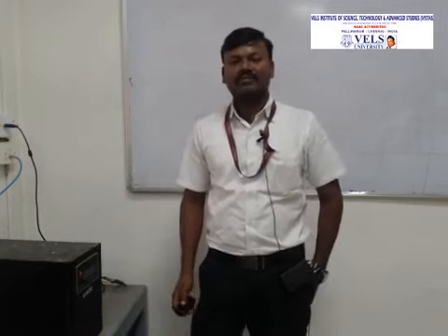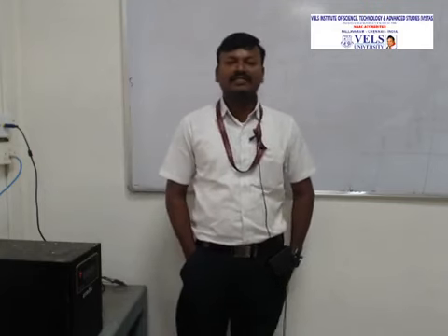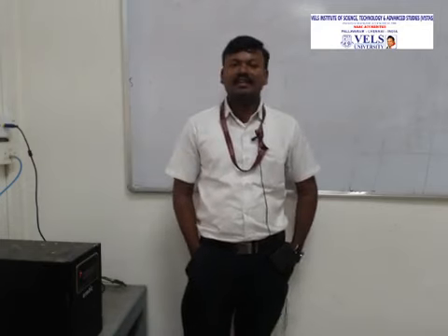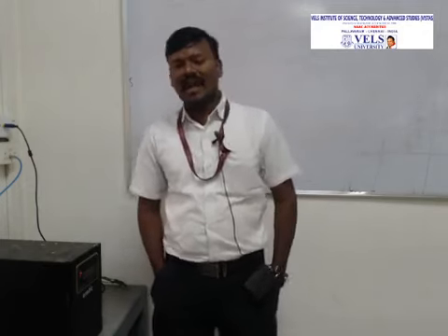So today we are going to discuss micromanipulation. So what is micromanipulation? It refers to the procedures which take place at the microscope level. That is the reason it is called micromanipulation. It is used to manipulate oocytes, eggs, sperms and embryos.